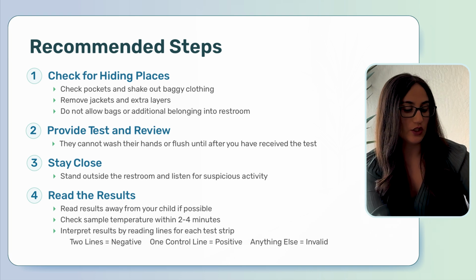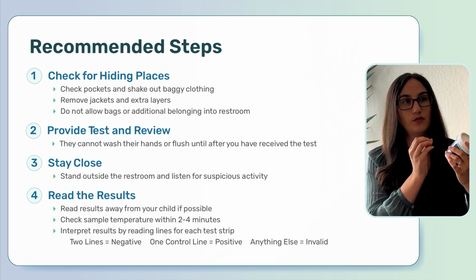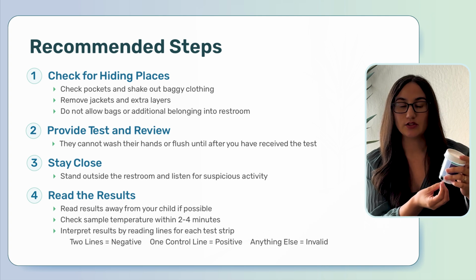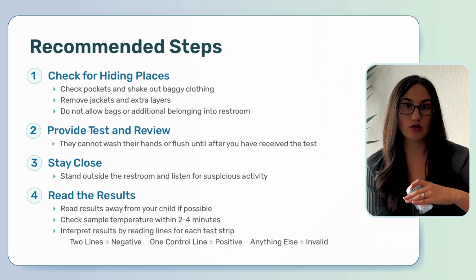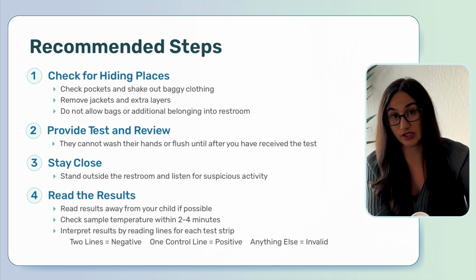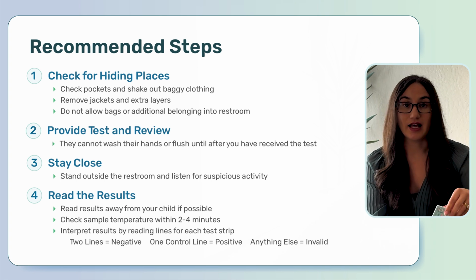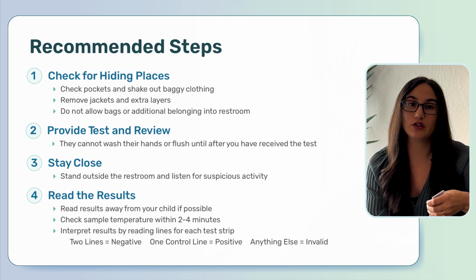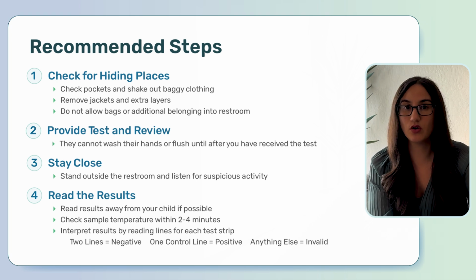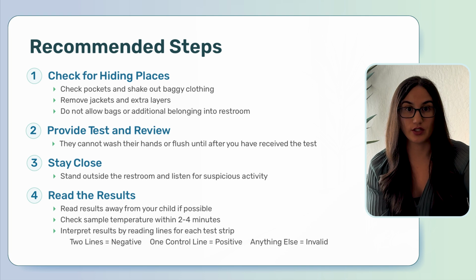Now, the other thing that you might notice on this cup is a temperature reading. So when looking at a drug screen, you're really hoping for the sample to be between 90 and 100 degrees. Now, not all drug screens are going to have a temperature reading. For example, if you're using one of these, it does not. That is okay. Really, what you want to be mindful of is when they hand you the sample, what you're looking for is for it to feel body temperature. It should not feel cold and it should not feel hot. Both of those would be more concerning.